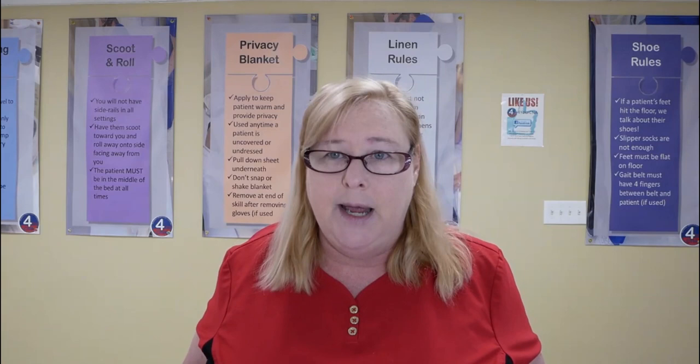When you're working with a catheter, the patient will not have a chucks underneath them to start. There's no need. They've got a catheter that collects urine. We don't need a chucks there to collect urine because the catheter is doing that job already. You don't want to put a chucks on a bed unless the patient needs one. Chucks are plastic lined. They're going to hold in heat. They're going to make the patient sweat.